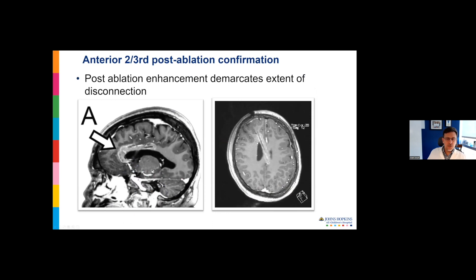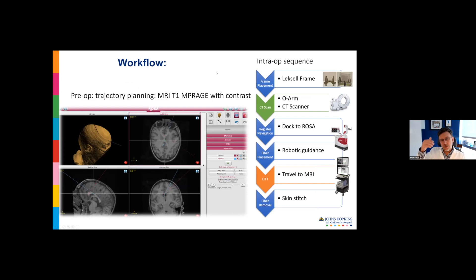Here's a video showing the Visualase two runs of ablation on the anterior fiber and about five runs on the body fiber. This is sped up about 100 fold. This process actually takes about 90 minutes once you're in the scanner. With the patient still on the scanner, you give a gadolinium injection and a T1 image, and you can see the zone of ablation conforms pretty nicely to the callosum.